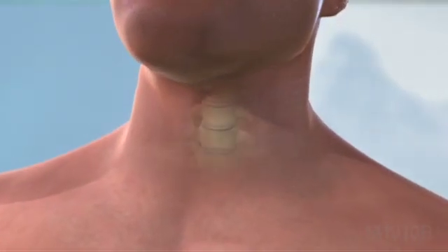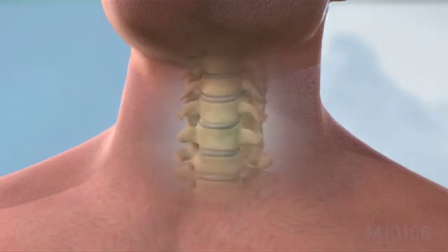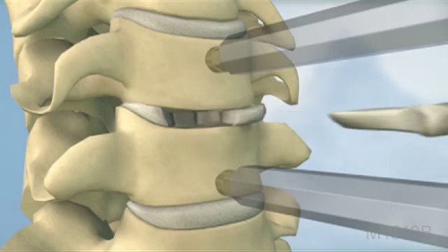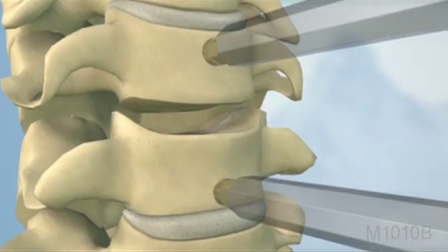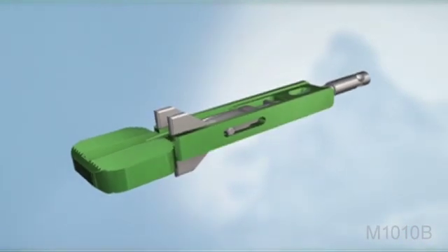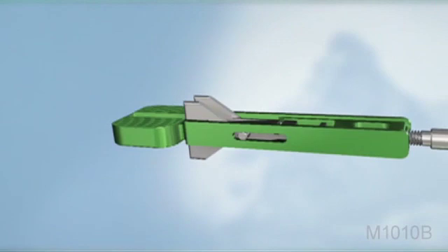First, an incision is made in the neck at the location of the diseased disc, and the soft tissues are moved away from the front of the diseased disc. The surgeon then performs a discectomy and remobilization, removing the diseased disc and releasing pressure on the surrounding nerves and spinal cord. Once the disc space is cleared and the segment is remobilized, a trial is used to assess the implant's size and position within the disc space.